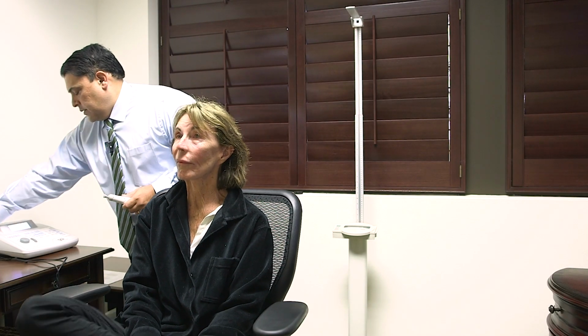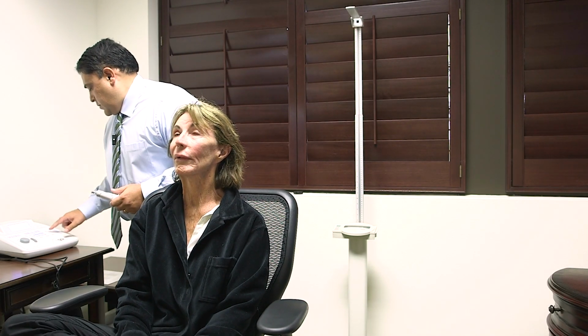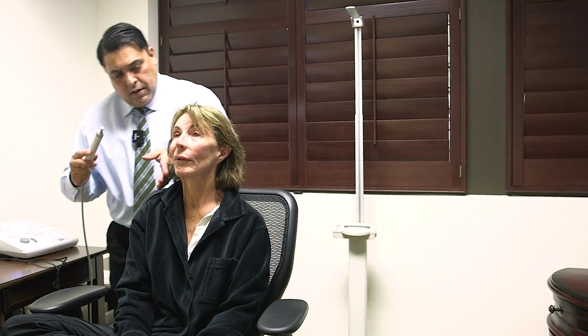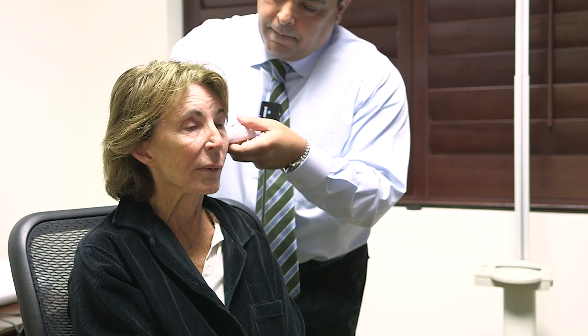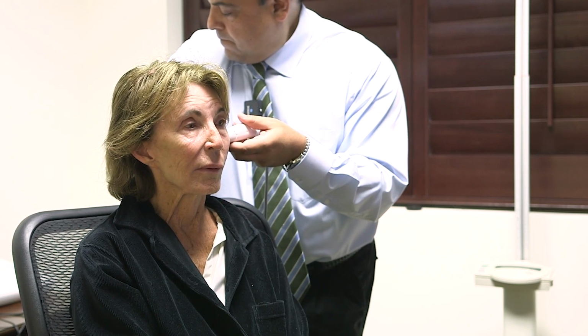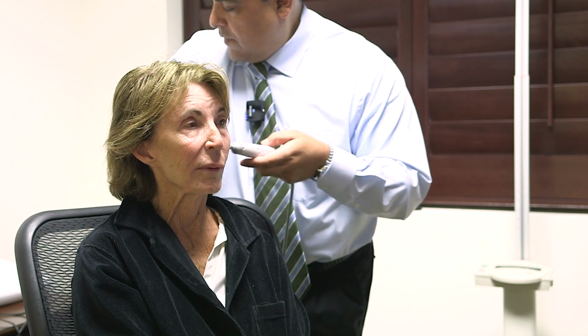Just going to check your eardrum pressure. Now when you hear a noise, Catherine, you're going to push this. Okay.